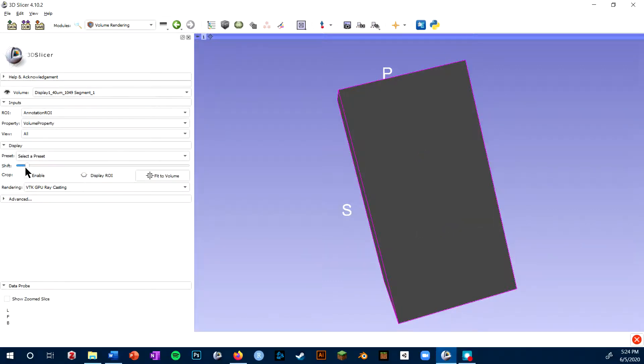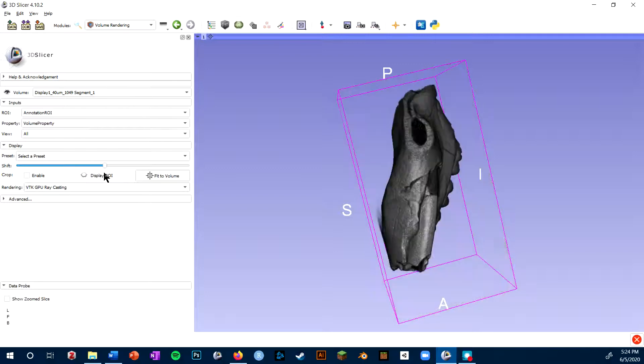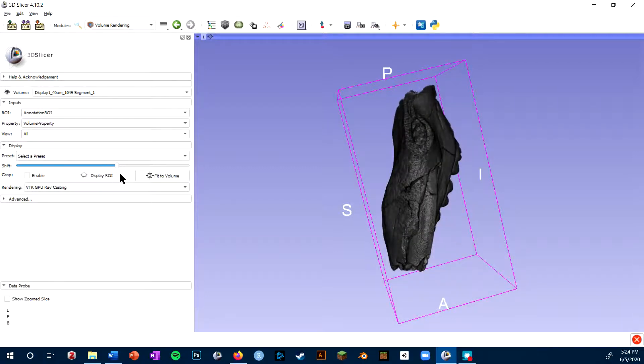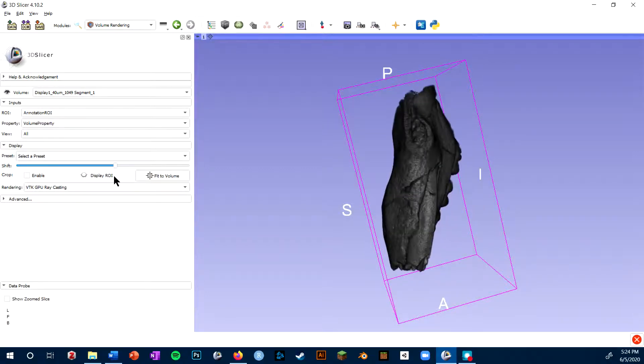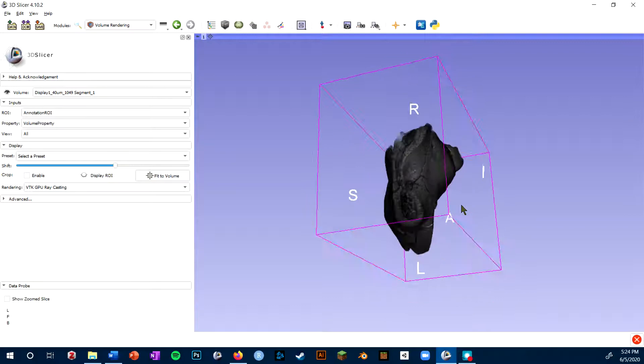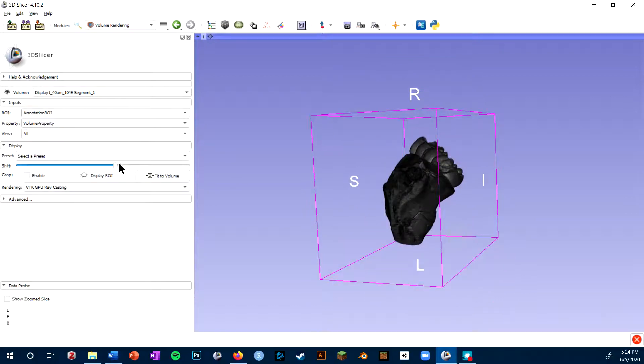However, as I start to shift it up, the air will no longer be rendered. And then as I shift it up even further, even the matrix and then the fossil itself will stop being rendered.